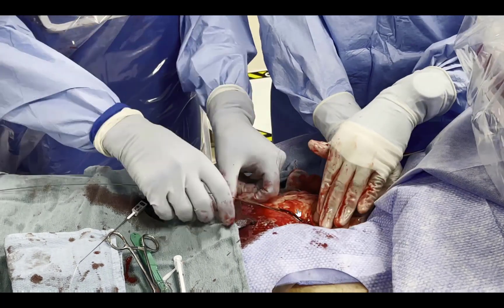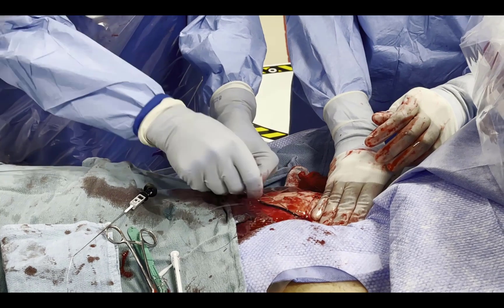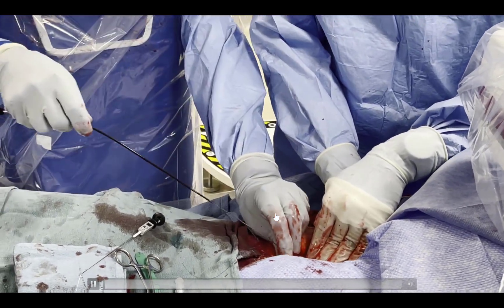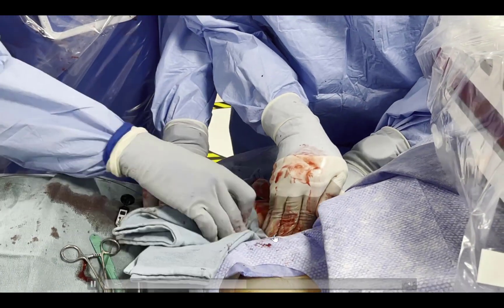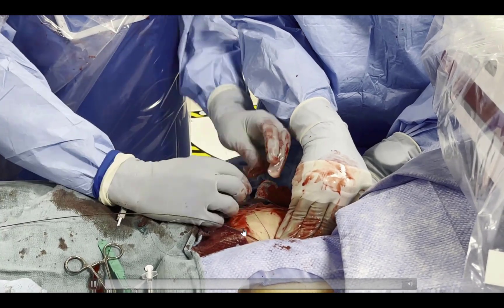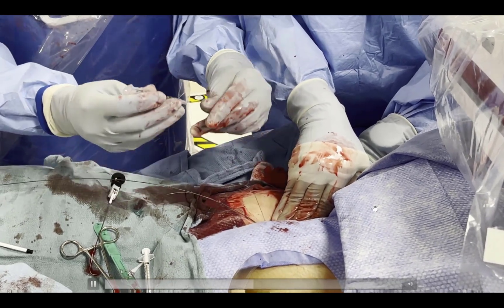We use the port of the per-close device to reinsert the 0.035 wire into the arteriotomy, maintaining access to the vessel so we can insert the large-bore sheath. Sometimes stiff wires are used for these large-bore sheaths, which can be done either directly through the per-close device or more safely after inserting a standard sheath and using a diagnostic catheter — usually a JR4 — to insert the stiff guide wire all the way up to the ascending aorta.